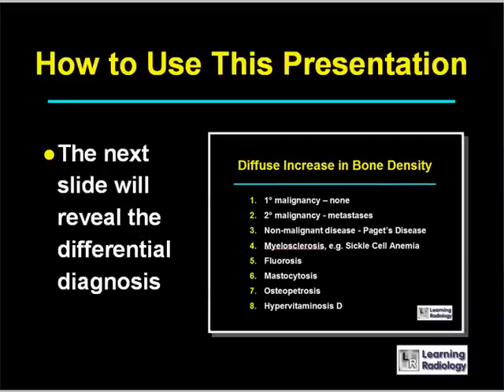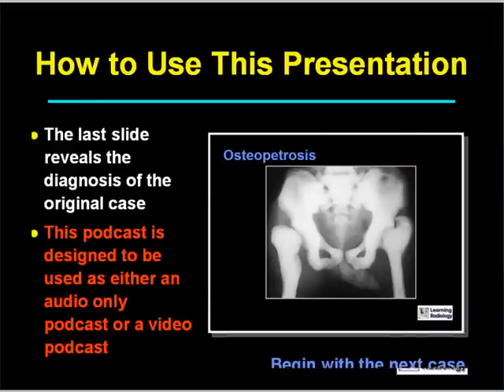The next slide will reveal the differential diagnosis itself, and the final slide will reveal the diagnosis of the original case shown. This podcast is designed to be used as either an audio-only or a video-only podcast, or both.